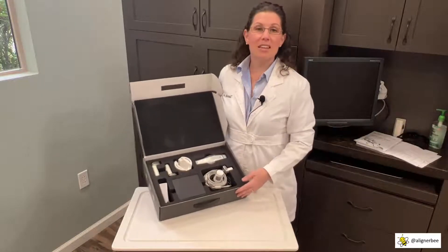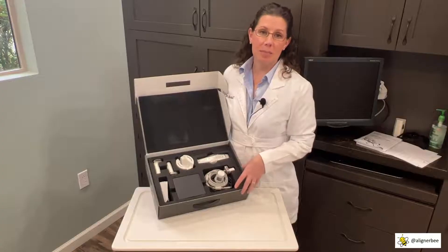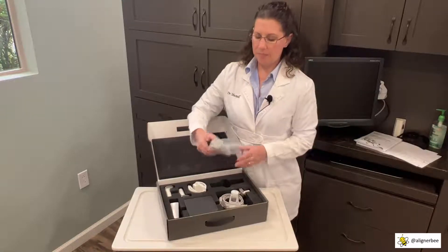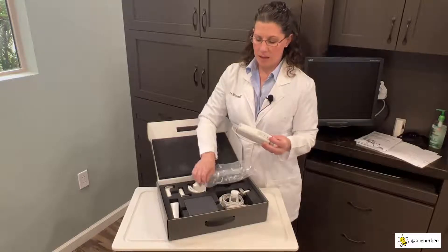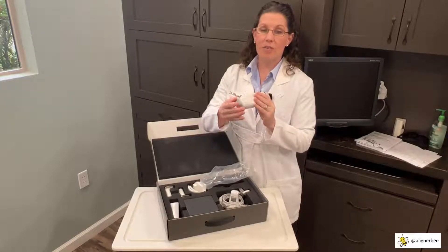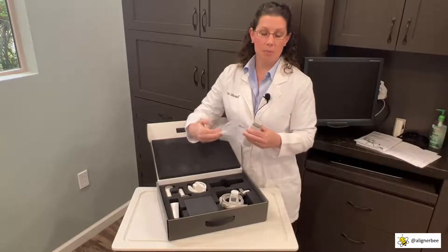We can see everything that comes with our CS3800 scanner. Let's start by removing the wand. The wand has a protective covering where the intraoral scanning tip goes, and a protective covering where the batteries go. We definitely want to save these in case you ever need to disassemble the scanner.